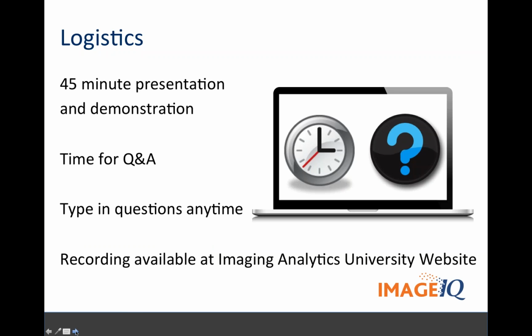You're actually going to see a live demo of the eMass solution, which is always a little bit thrilling when you do live software on a live webinar. So yeah, that's always a little exciting. There'll be times for questions and answers at the end if we're able to do things in a timely manner.